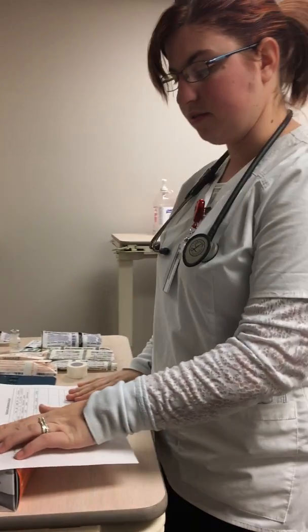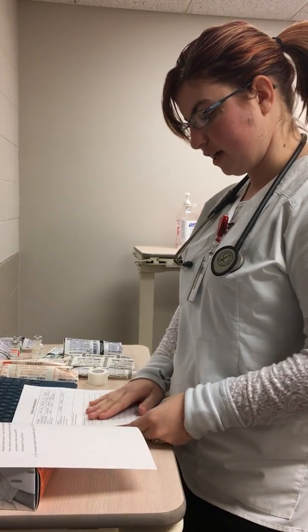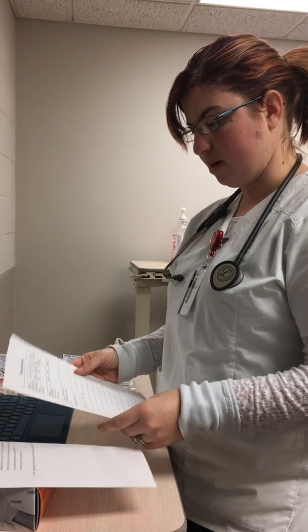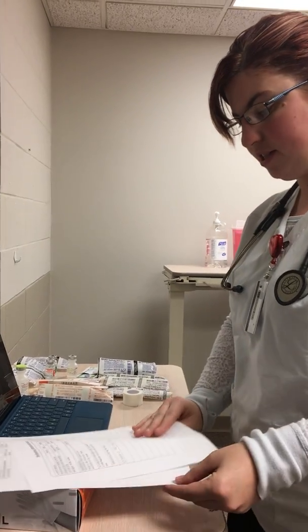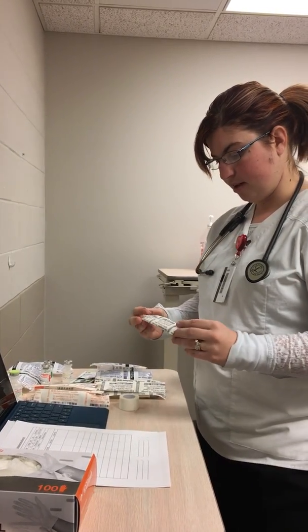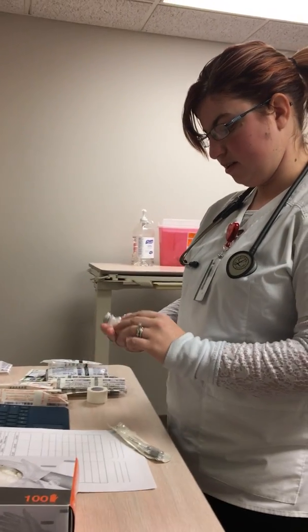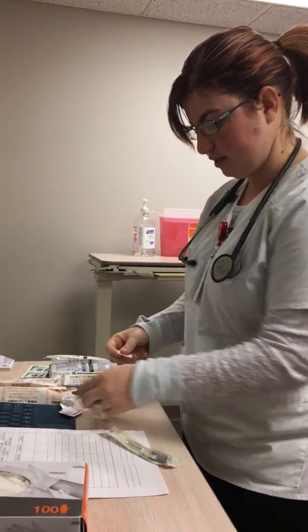So I'm going to come in the med room, and I've got the physician order, and the physician has ordered 0.1 milliliters of PPD. And I'm going to check my paper MAR, and it also says the same for Mr. Brown. And then I'm going to check my EMAR to make sure it's also correct in there, and yep, it all matches up. So I'm going to go ahead and draw that up, and I'm going to be using the TB syringe, and here's the PPD solution. So we're going to go ahead and clean this off.